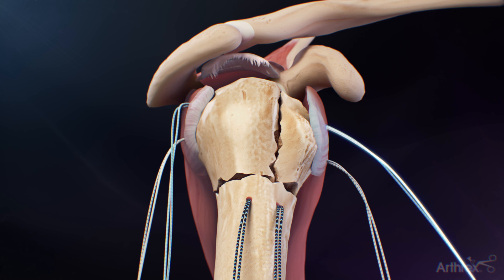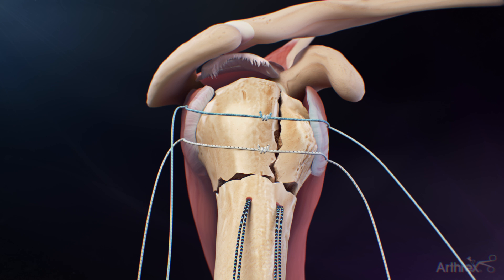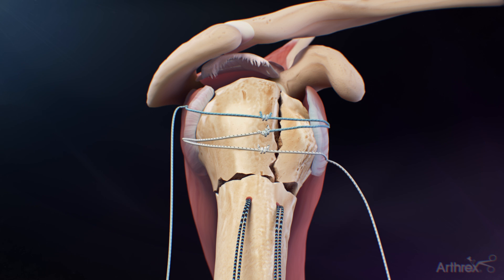Take one limb of the blue fiber tape from the lesser tuberosity and one limb of the blue fiber tape from the greater tuberosity and tie them together. Note, the strands are free-moving and won't tension when being tied together. Take one limb of the white-black tiger tape from the lesser tuberosity and one limb of the white-black tiger tape from the greater tuberosity and tie them together. Take the remaining blue fiber tape from the lesser tuberosity and the remaining white-black tiger tape from the greater tuberosity and tie them together. These remaining strands allow for the construct to be tensioned when tied.